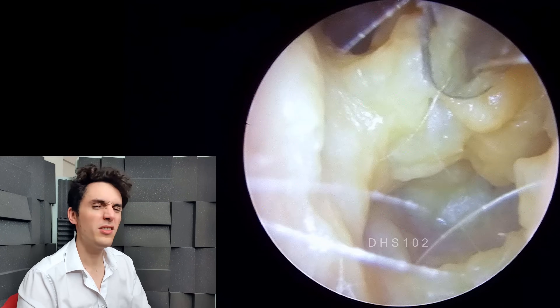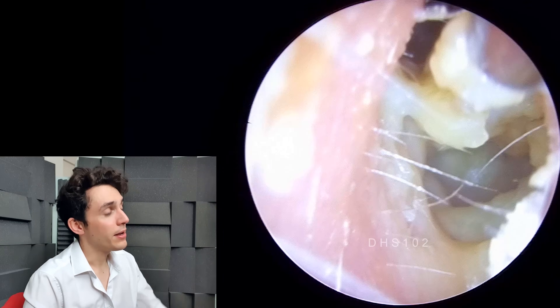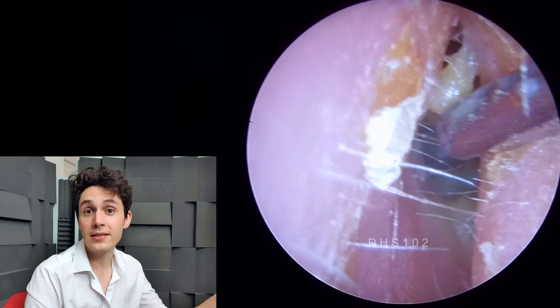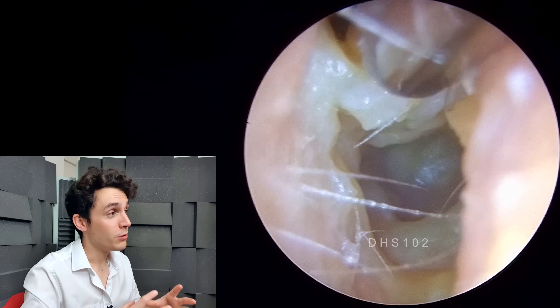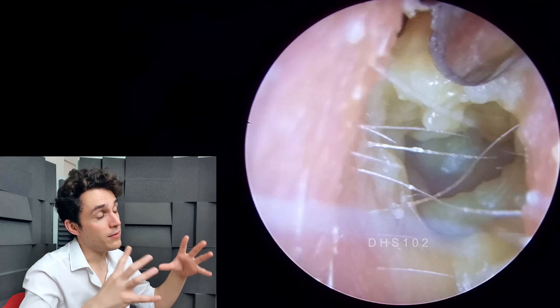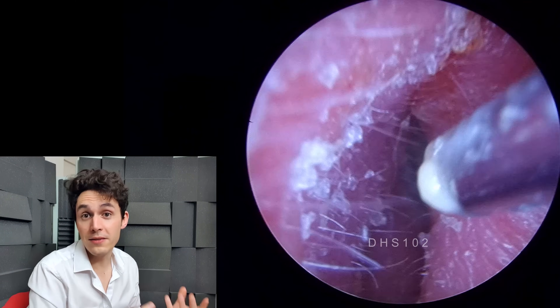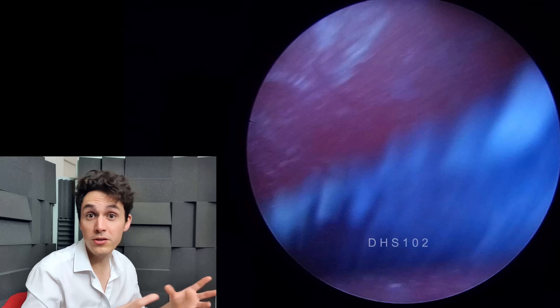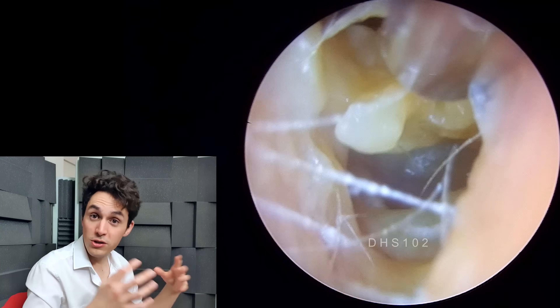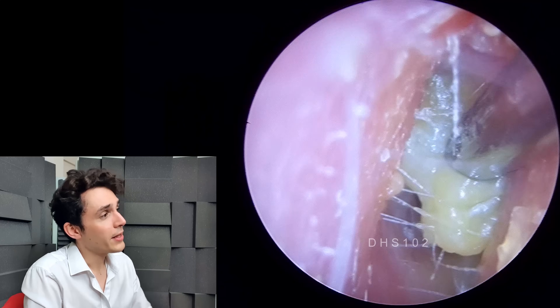There's probably pus in there as well — I should say purulent matter. Either way, this is what you tend to find, what you'd expect in an ear with otitis externa. The ear sheds lots of dead skin, as we've talked about in other videos. When there's an infection, the white blood cells in the tissue will release growth factor, which makes the skin produce and divide very rapidly — that's called rapid cell turnover. And you get this kind of rapid shedding of dead skin into the ear canal, and that's what we're dealing with here.